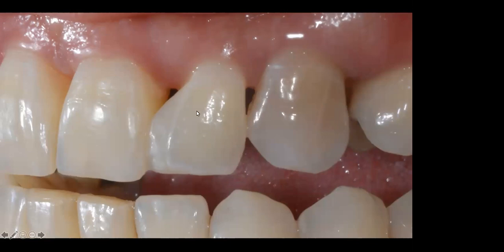So if we want to change the shape of a tooth and close a diastema or a black triangle, we need to change the emergence profile. So I'm going to ask a question to everyone on Facebook. If we're going to change the emergence profile, do you want to change it supragingivally, equigingivally, or subgingivally? Do you want to change the shape supragingivally, equigingivally, or subgingivally?